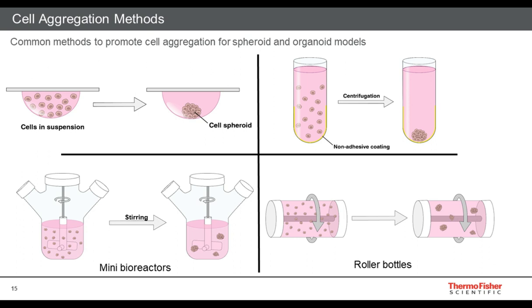Some of the reasons why this is done is that while it may help improve spheroid formation as well as consistency in the size of the spheroid, the agitation is also thought to help better feed some of these spheroids. So it tries to mitigate the effect of growing too large and forming necrotic cores, which may not be desirable for many cell models. It provides advantages there. Somewhat comparable to that, although less commonly seen, would be the use of roller bottle cultures, which would effectively do the same thing, but it is probably a less common approach in the literature from what I've seen.